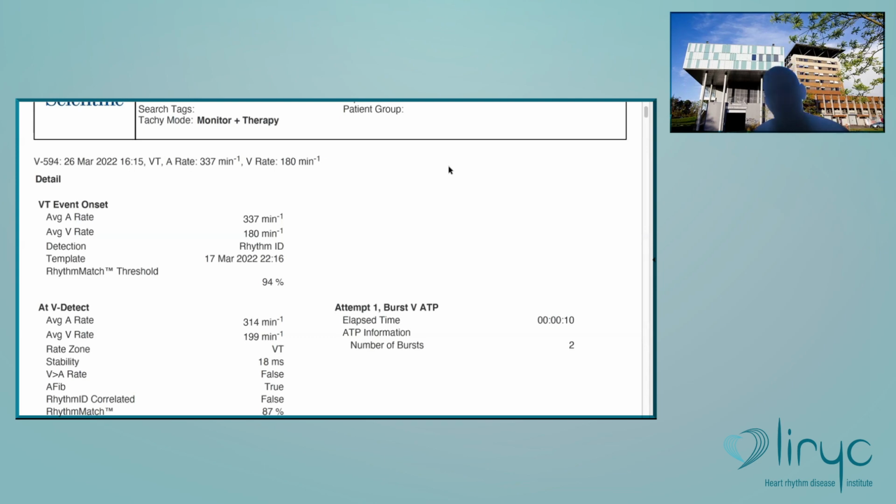So if you program the template on active, at one time, the device will systematically decrease the rate and prolong the AV delay to favor the occurrence of a spontaneous activation. And that's what I systematically program now in CRT devices, because when I analyzed all the tracings based on onset stability, the percentage of inappropriate therapy is pretty high.